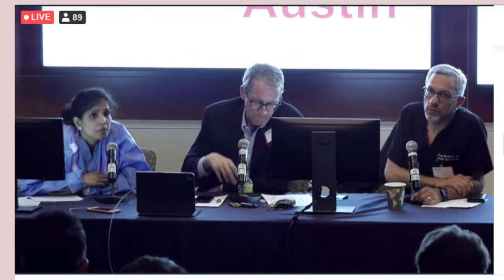We have a very active explant program with one of our surgeons, and so we've been using a lot of Micras in these infected patients. Typically we'll wait 2 to 3 days, but after 2 to 3 days, even with endocarditis, we've been implanting the Micra, and I don't know of a single case that's been infected. But we've seen one case with a big vegetation on the Micra. This was an IV drug abuser, so a very, very high risk patient. They will get infected, yes.